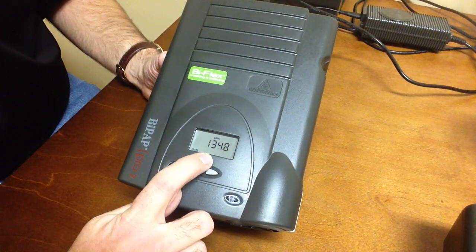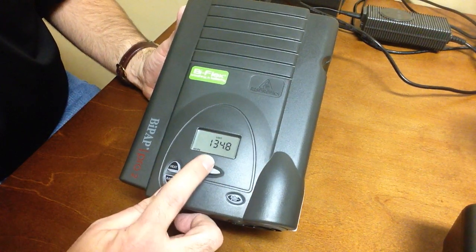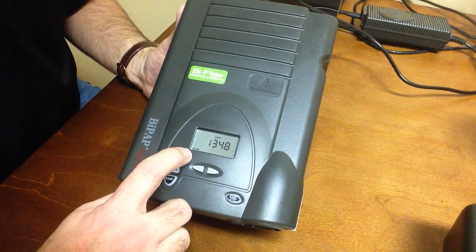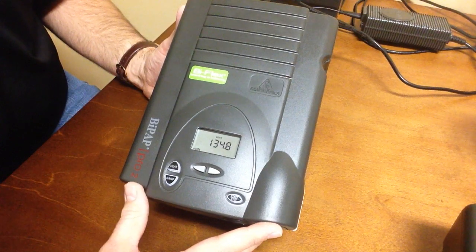The highest number is going to be the total machine hours. The last number displayed — for instance on this machine — is just the run hours, which can be reset, even though it does say 'hours' in the corner. It is the number just before this one that displayed, which was the highest number.